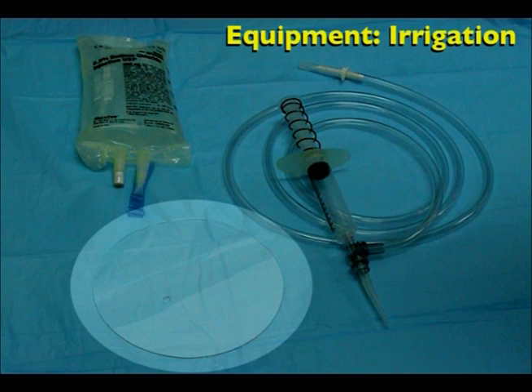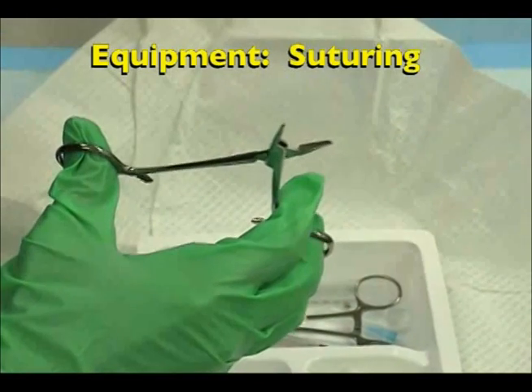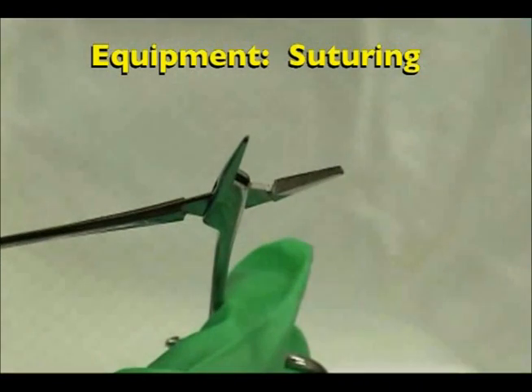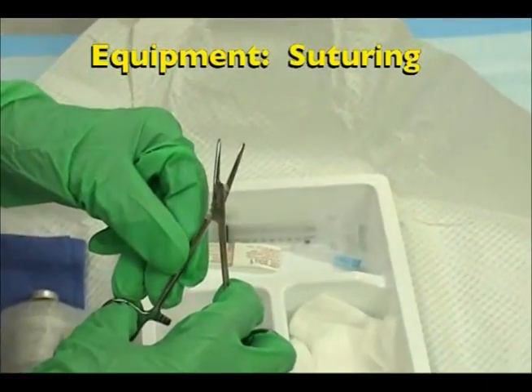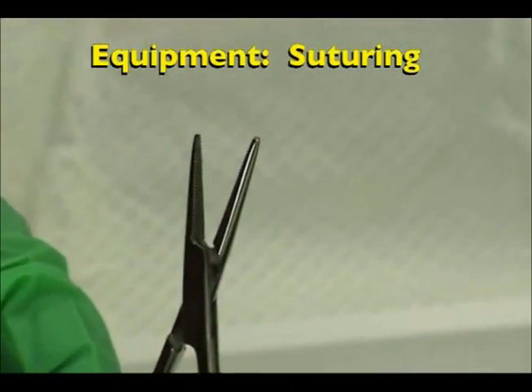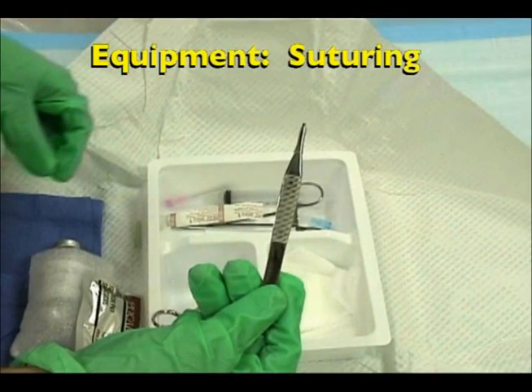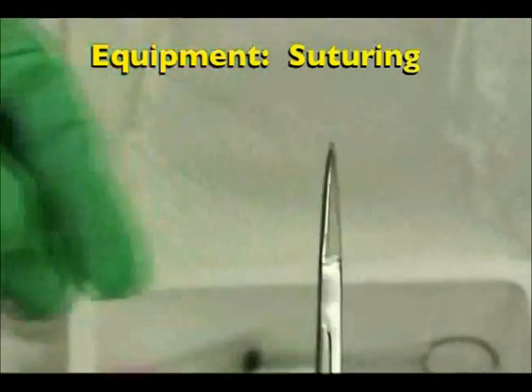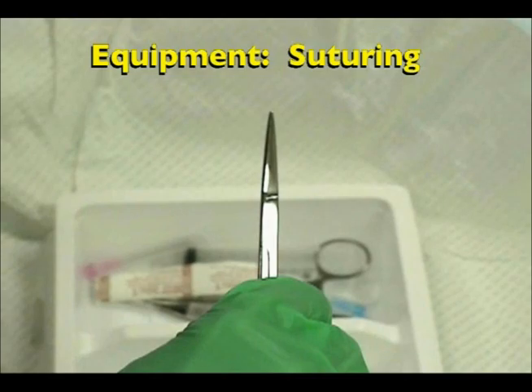The equipment in a typical suturing kit includes the following: a needle driver, which has no teeth on it allowing for easy manipulation of the suturing needle. In contrast, there is a Kelly clamp, which does have teeth on it and is used for tissue manipulation. Forceps, which are used for tissue manipulation, wound exploration, and needle handling. Iris scissors, which cut the suturing material once each knot is tied.